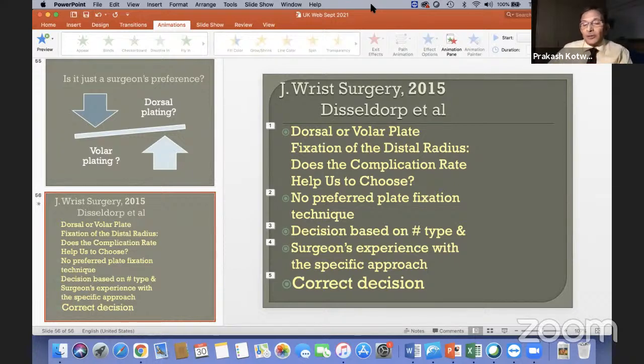And for an acute scapholunate dissociation, the treatment is relatively easy. After you have fixed the distal radius, all you need to do is reduce the scapholunate by manipulation and put a K-wire going from the scaphoid into the lunate. You can keep that K-wire for about 3 to 4 weeks. That is good enough to reduce and heal the scapholunate ligament injury, and generally it doesn't require anything more than that. This is as far as the acute injury is concerned, if it is diagnosed in time.